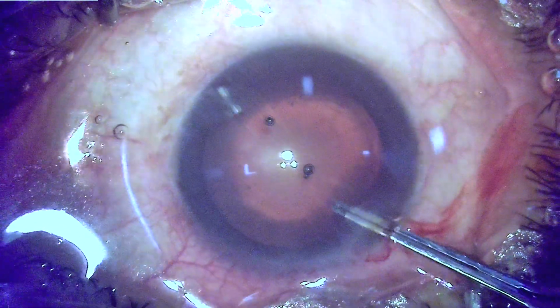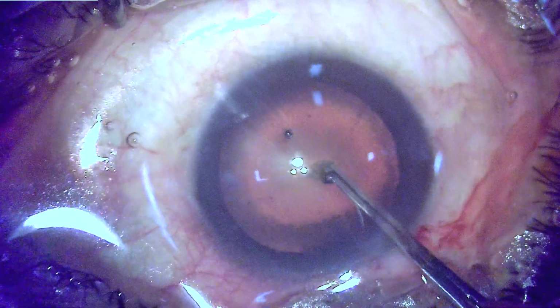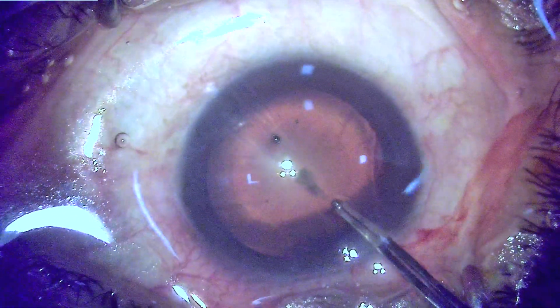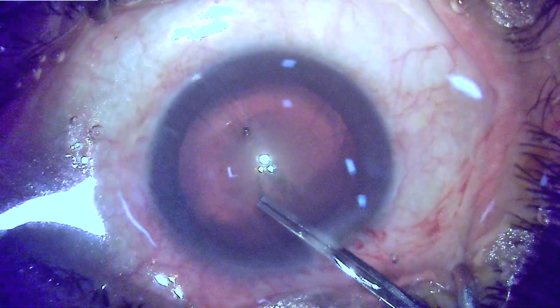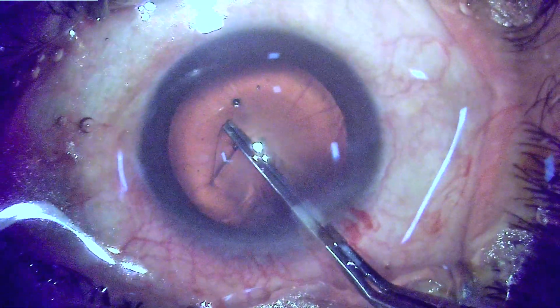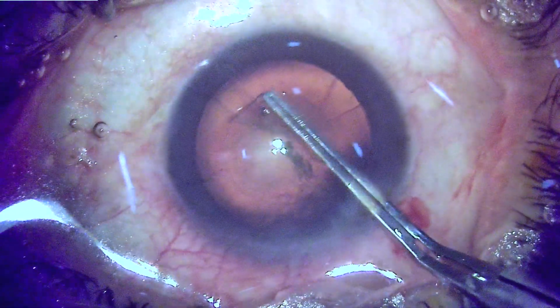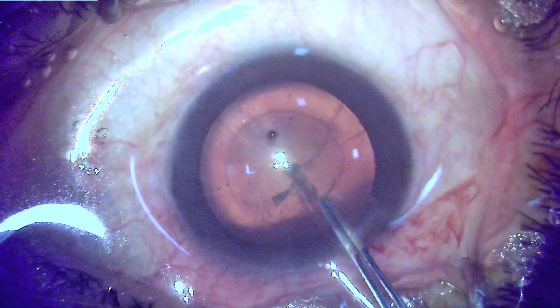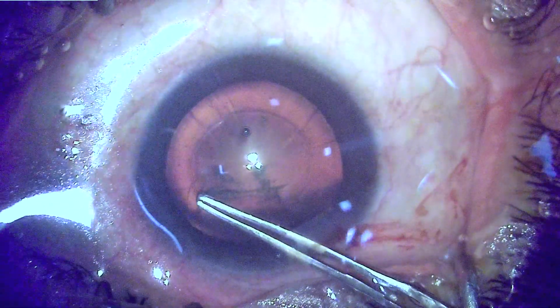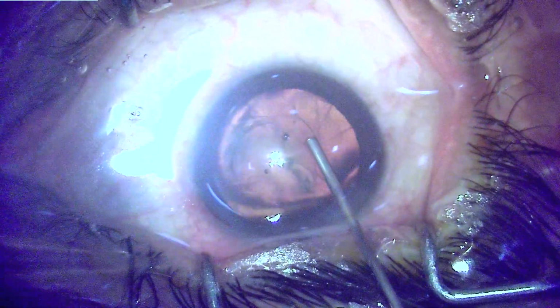A good capsulorhexis is a must for any given case, same goes for this. So as usual, I lacerate the capsule using the rhexis forceps itself and propagate the rhexis using the same forceps. This being a situation where the steep axis was on to the 127 degrees, so it was for a right-handed person, it was a situation which was very ideal.